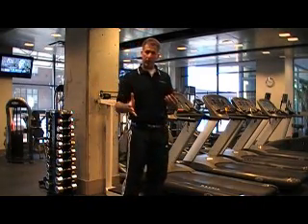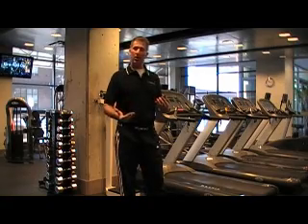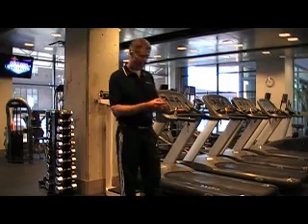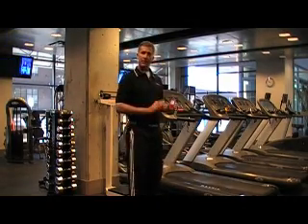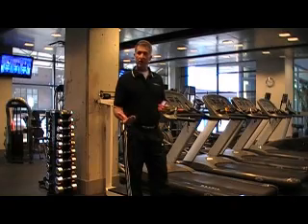Let's remember that height of jump right now. When we look at this eccentric utilization ratio, I'm going to compare the height of jump from the vertical jump to the squat jump, so we've got 13.8 inches. I'm going to go ahead and save this test information, which can be downloaded into the MyoTest software.